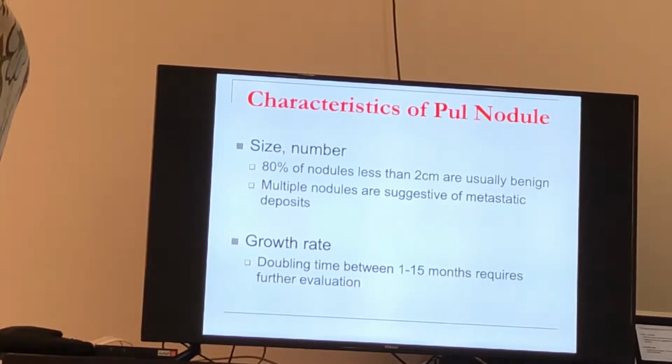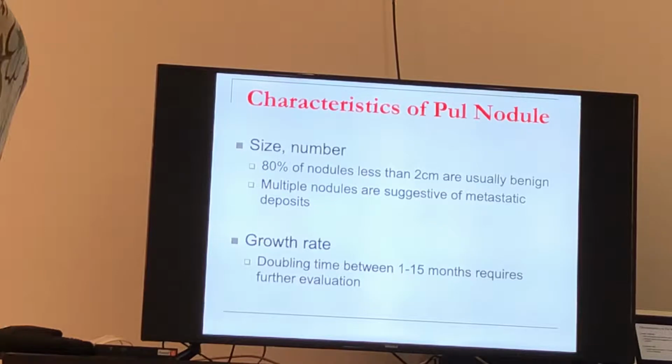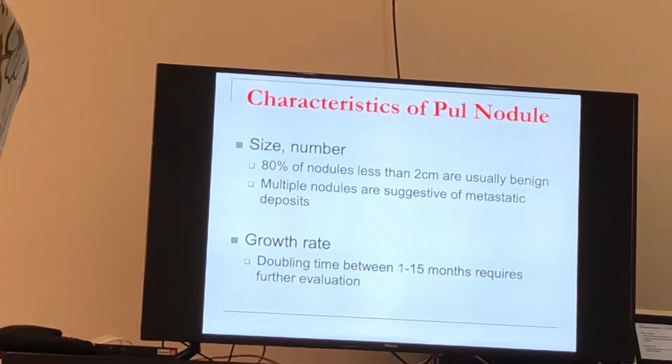Of course, growth rate is something old we used to depend on. Now, because of the high availability of CT and HRCT, usually we do CT imaging and we follow by something called the Fleischner classification of pulmonary nodules. There are different graphs according to the number, the size, the risk factor, how to follow up each one, which one to dig for and which one to wait and follow up.